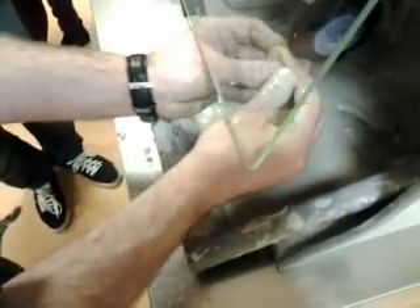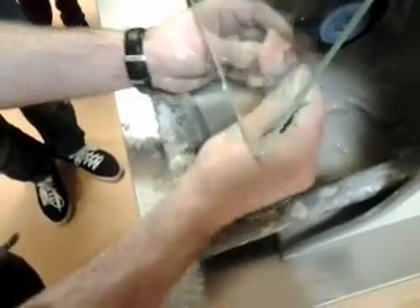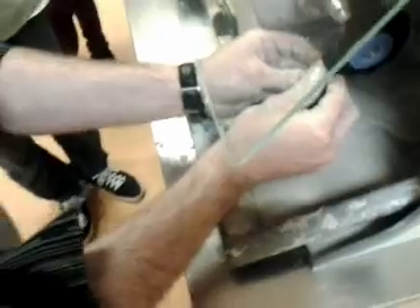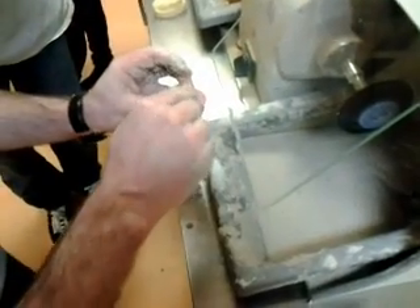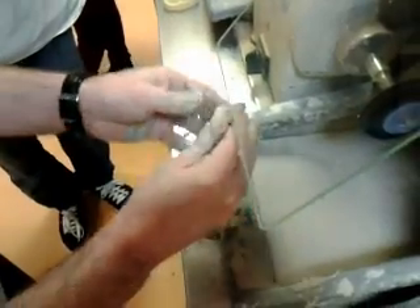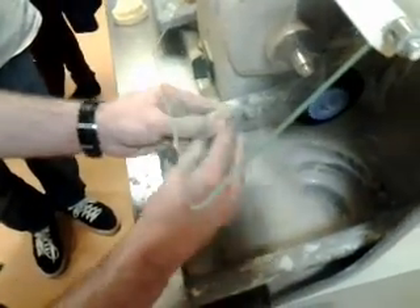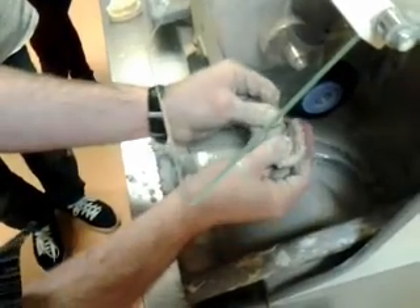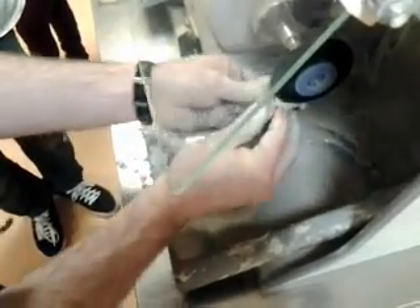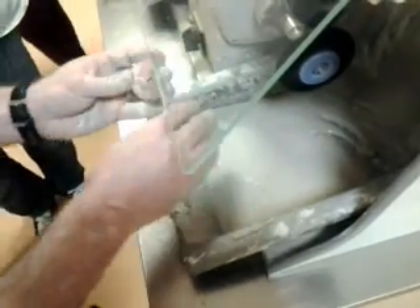Some aspects of this will need further rubber wheeling first. You need to make sure that before you move on to the next process you've done all you can at the current stage. For example, when rubber wheeling you need to get as smooth as you can with the rubber wheel before moving on to pumicing, otherwise you're not going to get a good finish.